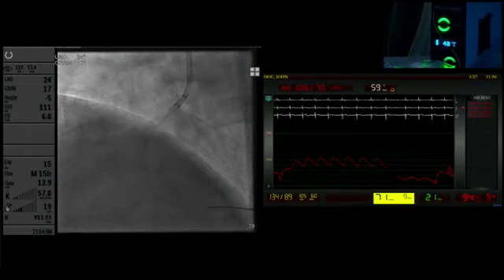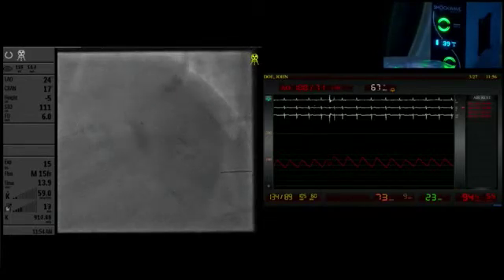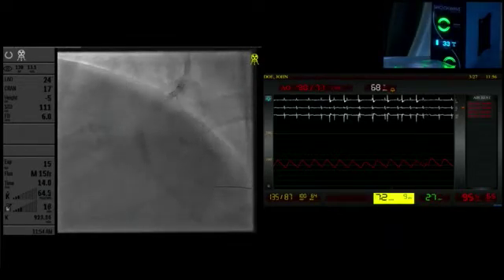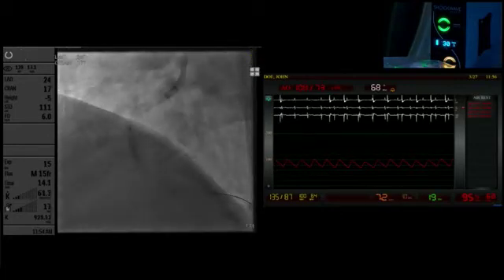But that's when we were being extremely careful when we first started. But I actually think we're probably going to just move ahead, just deploy. I think it's going to be low pressure. The indentation is gone. It's gone. Yeah, we will do an OCT to see. We'll repeat OCT now after we deploy it. Yeah, I think that's the difference. You will see it right now. 6 again.